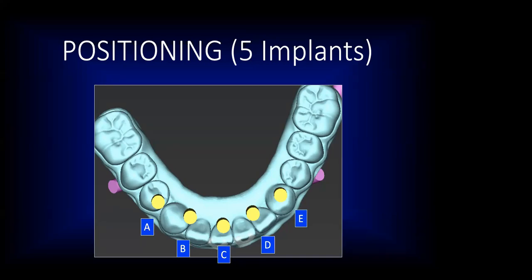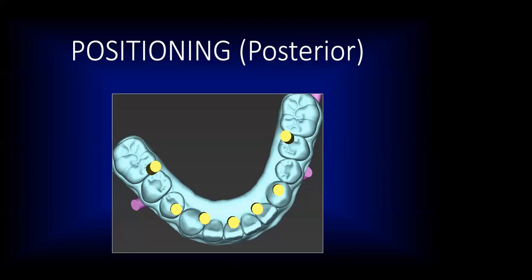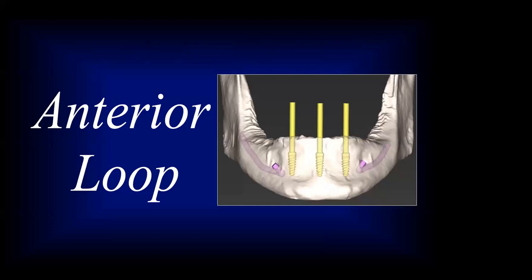So you want to go through this. Again, give the analogy. Implants in the posterior, can you put them in? Possibly. But for an overdenture, usually we're not doing that. You don't really need implants in the posterior unless possibly you were doing an RP4 or there was a site in the anterior that was complicated because of some anatomic variant or some bone issue, bone quality or quantity.